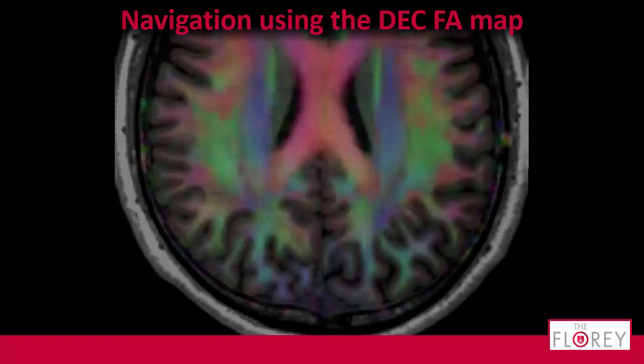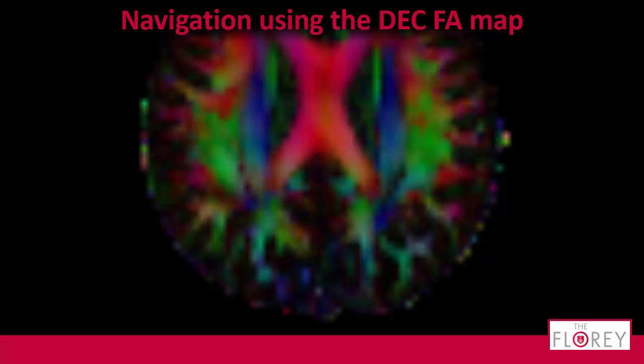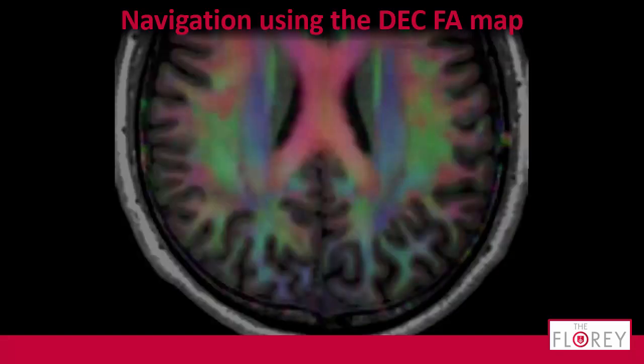Maybe it's just because I interpolated the DEC FA, so I'll get rid of the anatomical image. Oh, good lord, this is ugly, so I'll add the anatomical map again. And now it's very white. Yeah, the colors come back a bit. It's all nice. You're onto something, right?